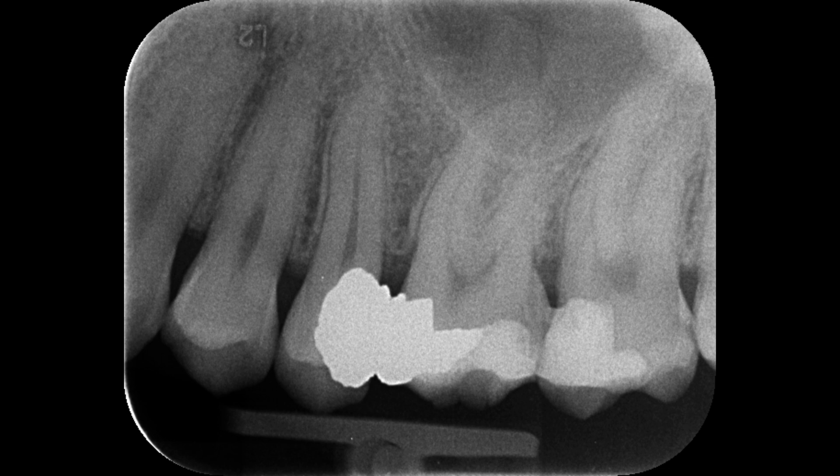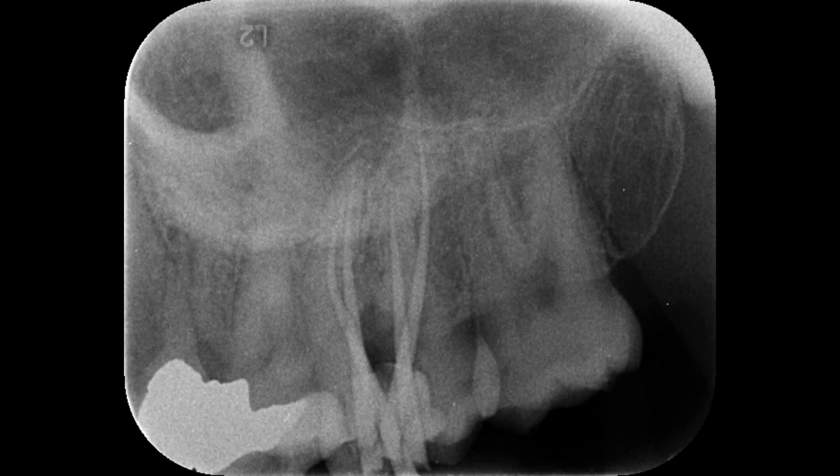I started the root canal treatment of the maxillary second molar tooth — prepared the canals, shaped them, and then obturated them very well. What I found was that there were not just three, but four canals in this maxillary second molar tooth. Usually it's three, but in this case it's four. Here is the working length radiograph, where you can see very well-tapered canals.